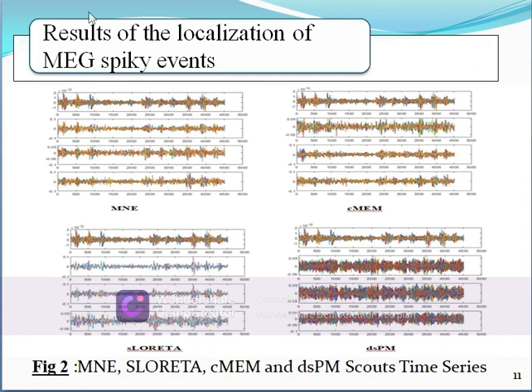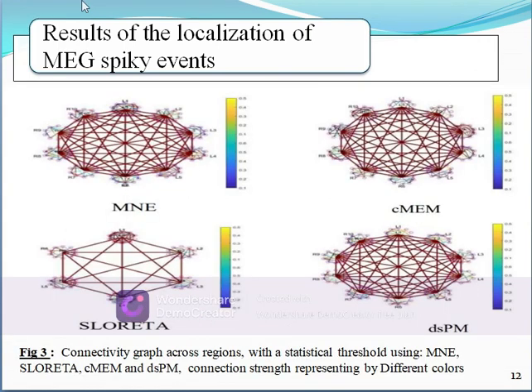For each region of interest, we have reconstructed the time series using the singular value decomposition following the projection on the original dipole. The following figures explain for the patient the time course at the level of the source. Then for each region active during this discharge, we calculate a time course estimate.